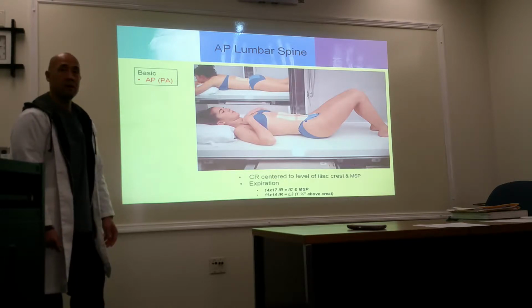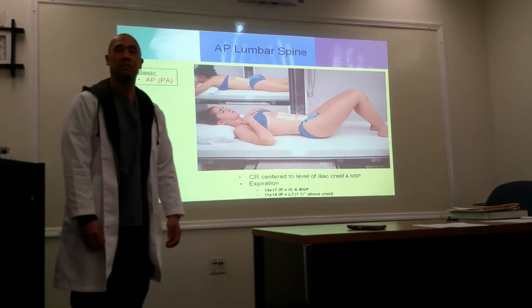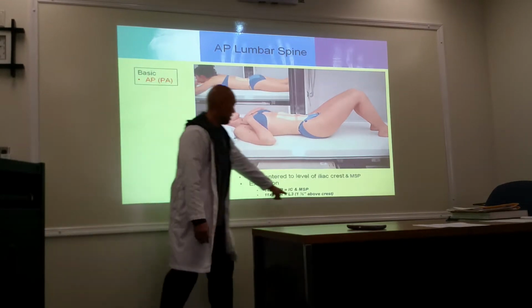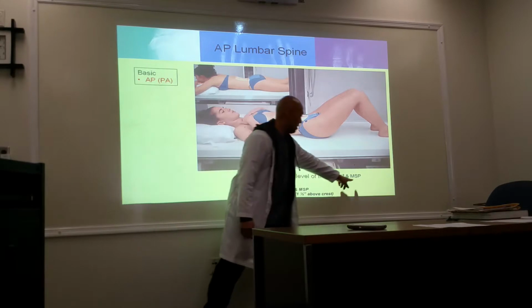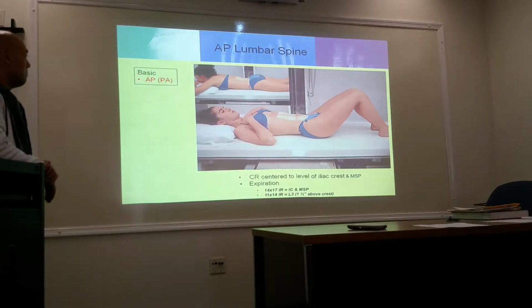Did you change it to MSP right there? Because on mine it says MCP. MCP is mid-coronal plane, and MSP is midsagittal plane. So change that to MSP. It even says it right there. So for large, at the crest; for small image receptor, 1.5 inches above the crest.